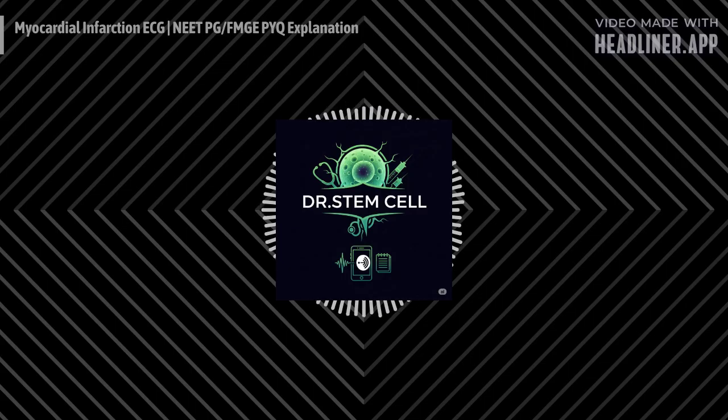But here's what many students miss. These numbers are just the beginning. What do you mean? Well, you also need to look for reciprocal changes. In an inferior MI, for example, you'll often see ST depression in leads I and aVL while having elevation in II, III, and aVF. That's fascinating.